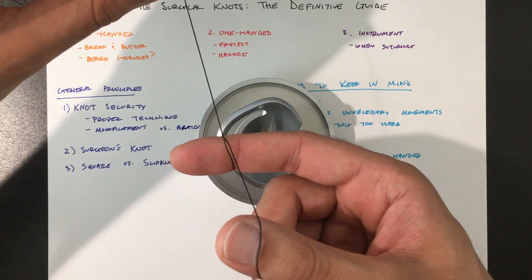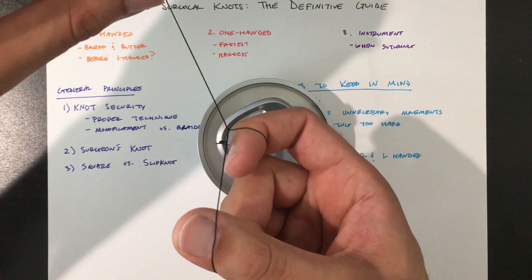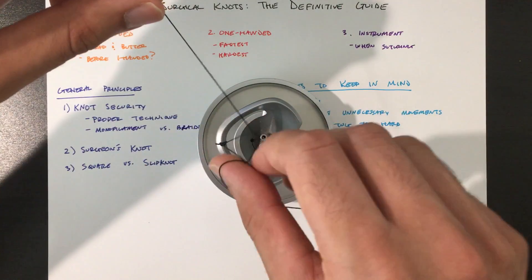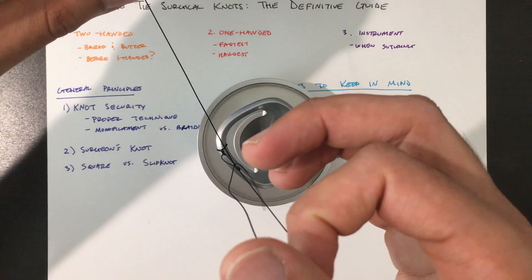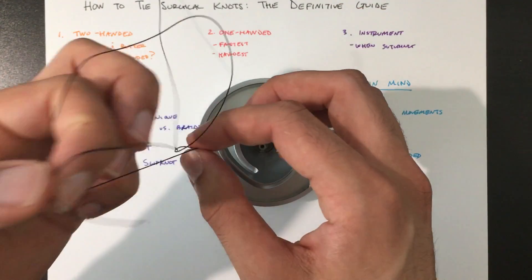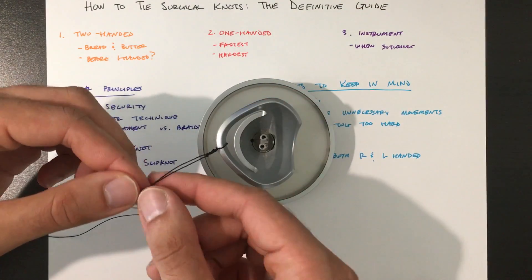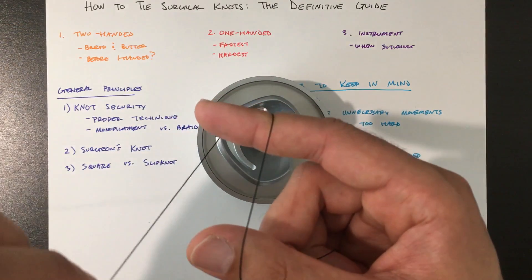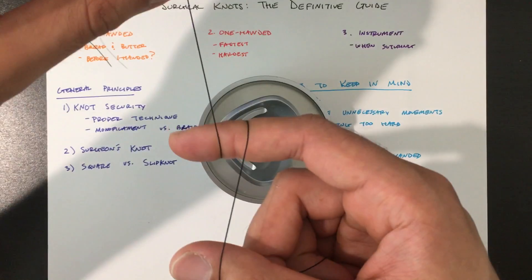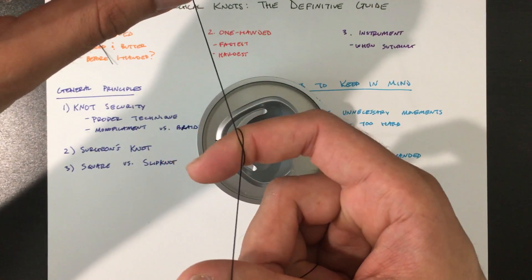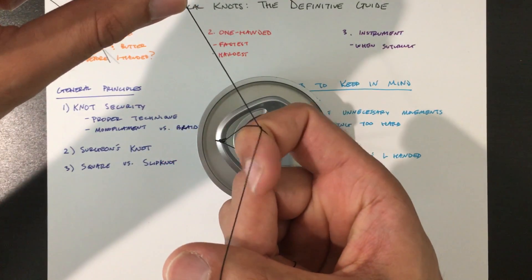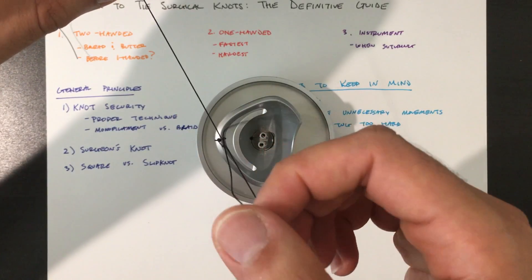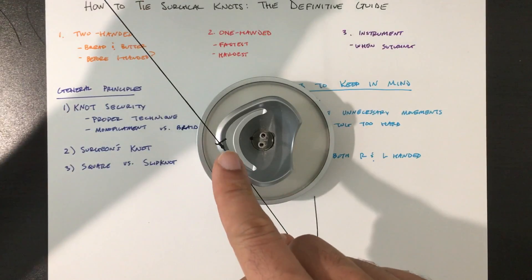You have your two sides like so, you need to loop this. Grab this, grab this, and bring it in. Let me show you that one more time. Again, here's the gun. Opposite direction. Bend your index so you can grab this end and pull it through. That's the hardest part.